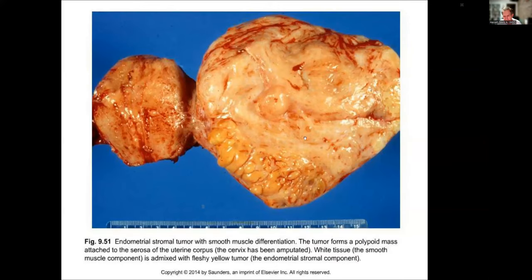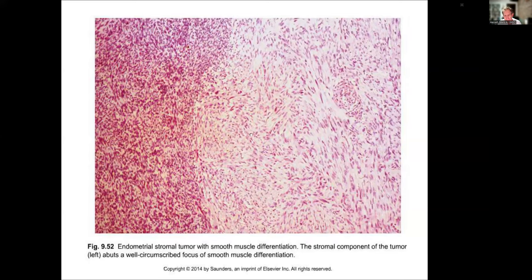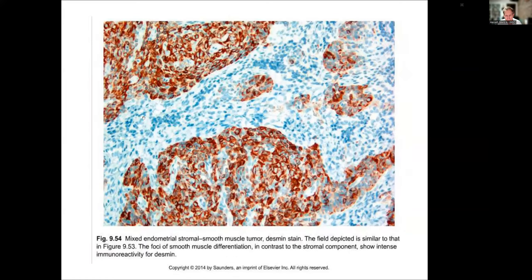Occasionally, you'll get smooth muscle differentiation, which is what you're seeing here. Here's the stromal sarcoma, with nodules projecting into the muscle, and then some additional smooth muscle differentiation in the tumor here. And you can see these are more spindle-shaped cells compared to these polygonal cells on the left. Muscle markers might show a few areas of Desmin positivity in these tumors if they have that smooth muscle differentiation. That's okay, but the majority of the tumor should not be positive for Desmin. This would usually be a fairly localized feature.